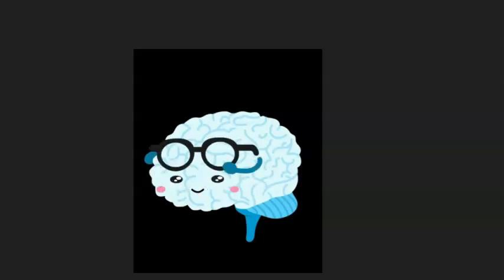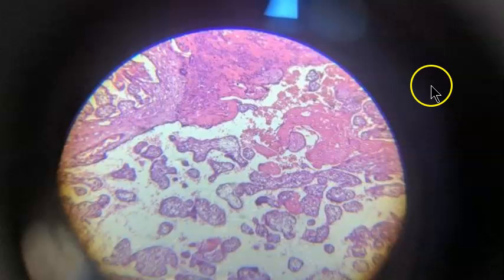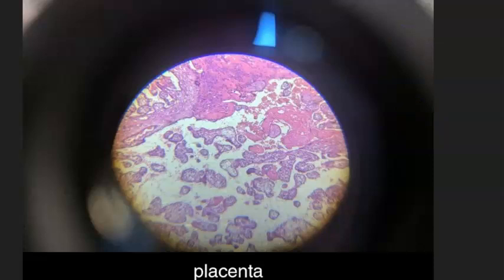How's it going so far with all the optic nerve and the brain, the pituitary? You saw the cerebrum, cerebellum. Shall we continue? We have now reached P. This one also is from P. Can you say? Can you see villi structure here? Pretty easy to recognize this one. It's placenta. Very good. Placenta.